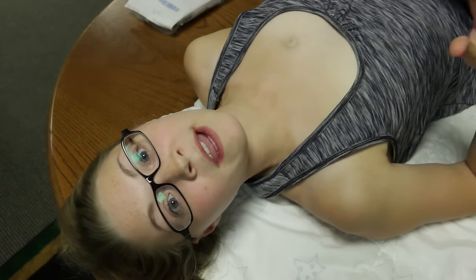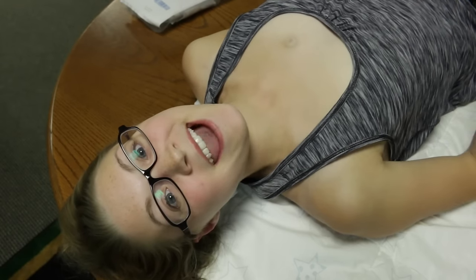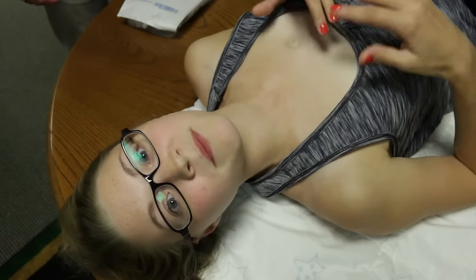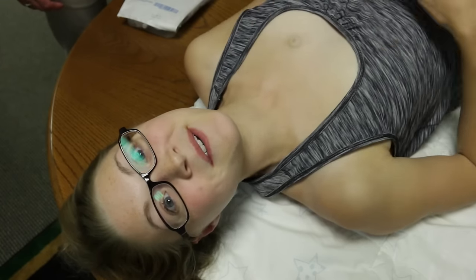You want to find somewhere where the person accessing your port can reach you and has space for a sterile field. Accessing your port can be done by yourself but it requires multiple pairs of sterile gloves and being creative, so if possible having a second set of hands is helpful. You can use numbing cream ahead of time — just put it on and leave it for about half an hour. I don't use it anymore; it's a quick pain so I'd rather just deal with it, but it's totally your choice.